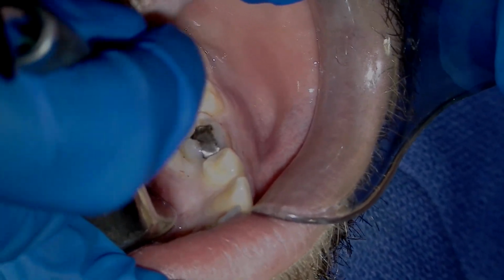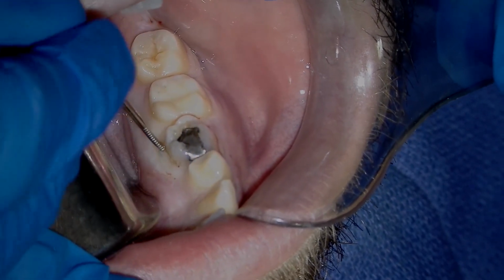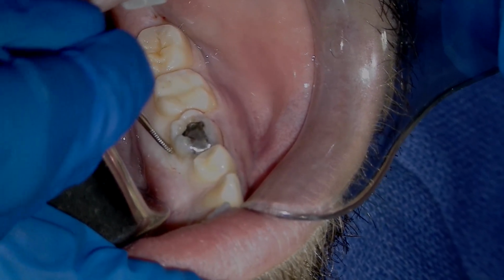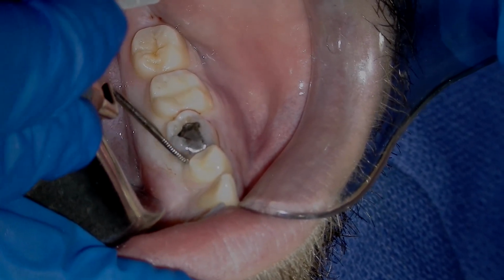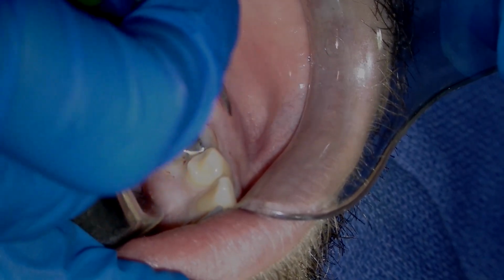I'm going to walk around that, first on the lingual side, and then I'll follow through on the buccal side. And I just want to encircle that tooth all the way around to make sure it's free, so I'm not tearing any of the gum tissue when I lift out the tooth.